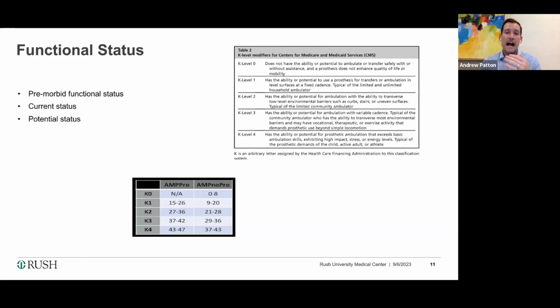So we're talking about high level athletes that need specialized components for the sport that they're doing. When you think about the Olympic blade runners and people who do competitive rock climbing and need special attachments for their leg and things of that nature. So these are high level, more specific things, as well as children, because they're super active and they're growing all the time and they need special little components. So kids, and then specialty components for high level athletes is what a K4 would be.